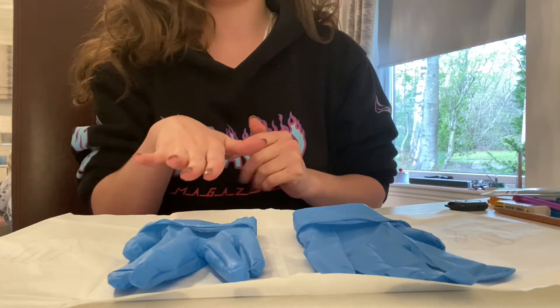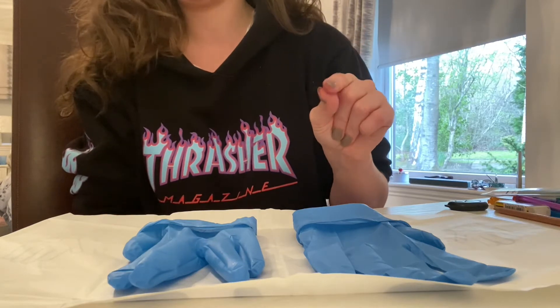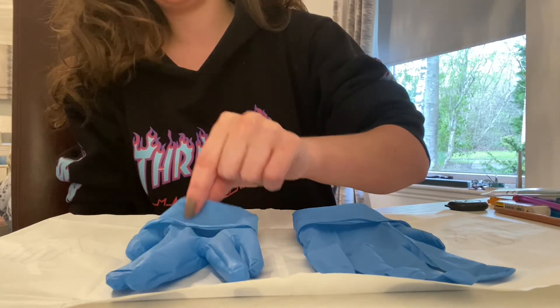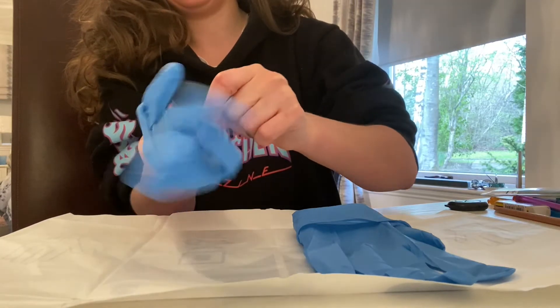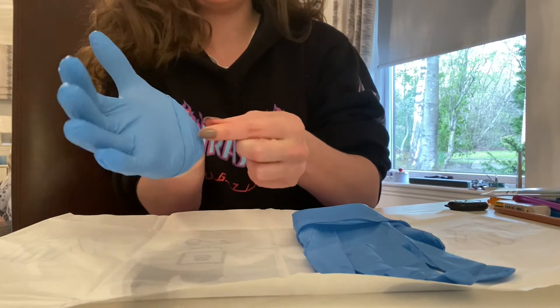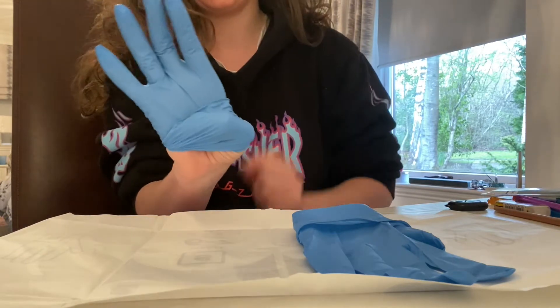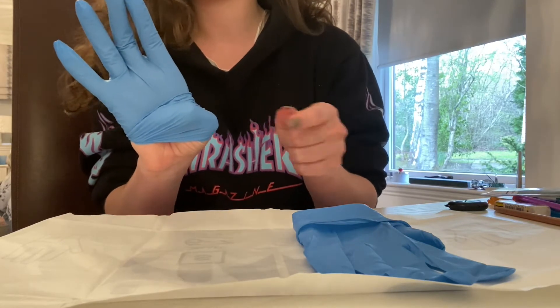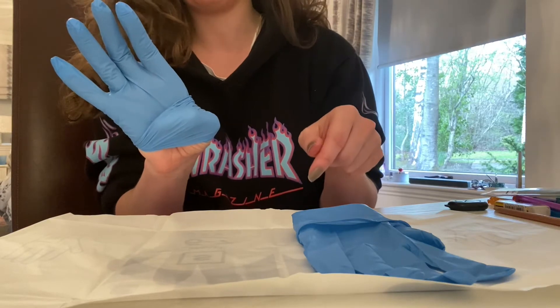I'm going to put on my right glove first, using my finger and forefinger to pinch the cuff of the right glove, sliding my fingers inside, then pinching the cuff and tucking my right thumb. My right thumb is now safe and I won't accidentally catch anything while putting on my left glove.